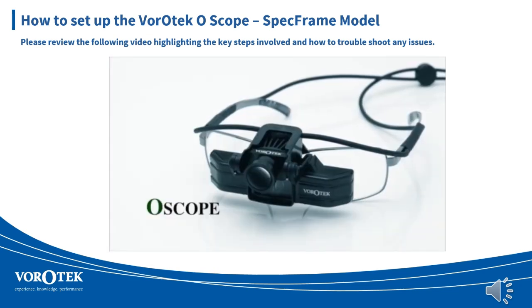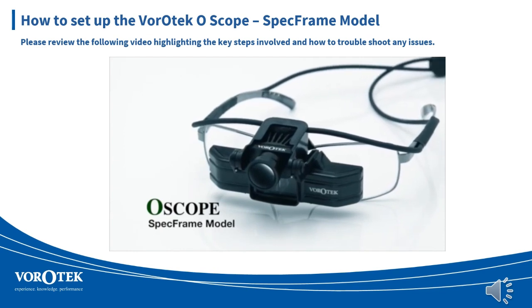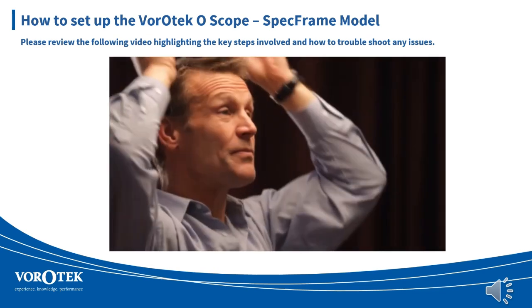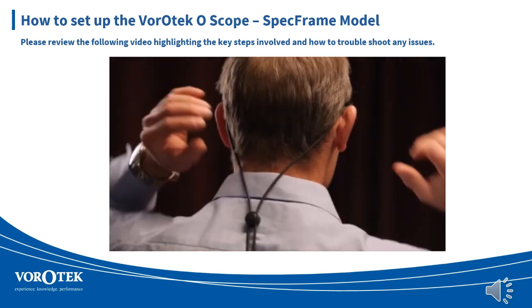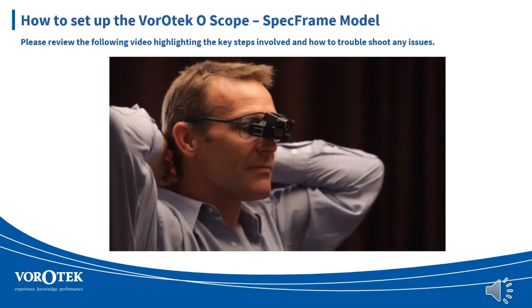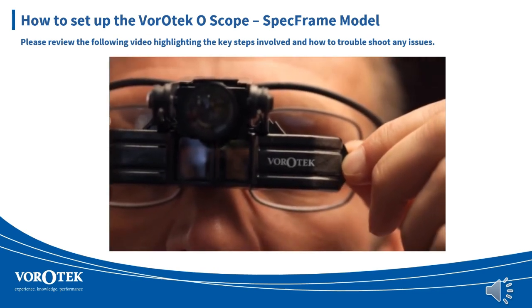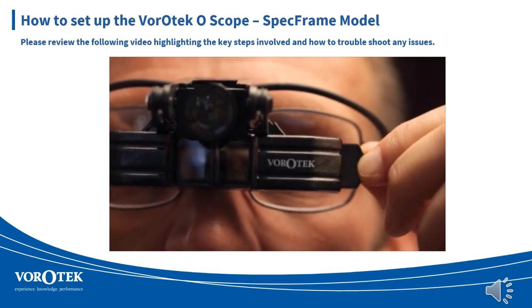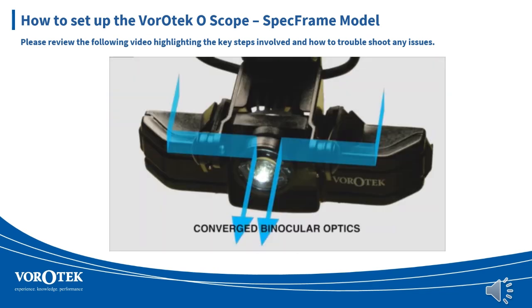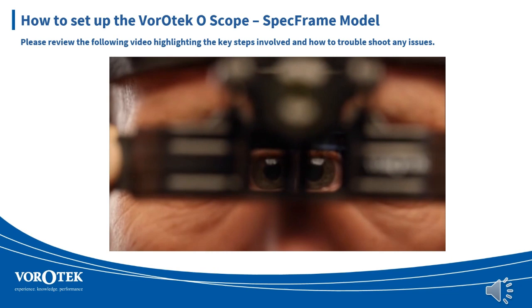This video is to ensure your scope is correctly set up and specifically aligned for optimal visual performance. With an adjustable spec frame model, ensuring correct alignment is paramount for optimum visualization. To adjust the interpupillary distance for correct alignment, simply slide the tabs located at each end of the converged binocular optics. This moves the mirrors to match your eye width. The correct alignment will occur when your pupils are in the center of the viewing screen.